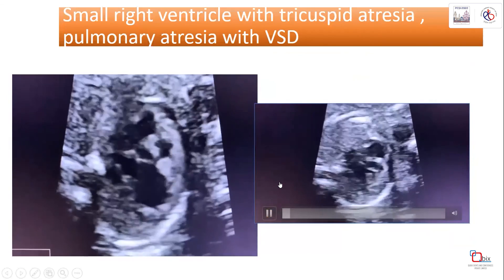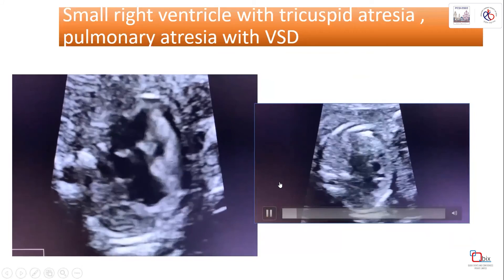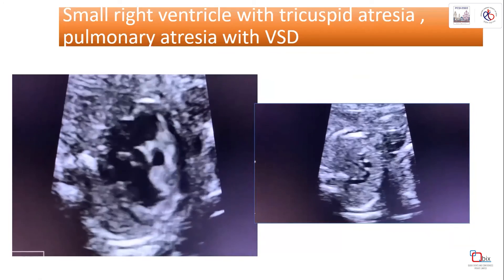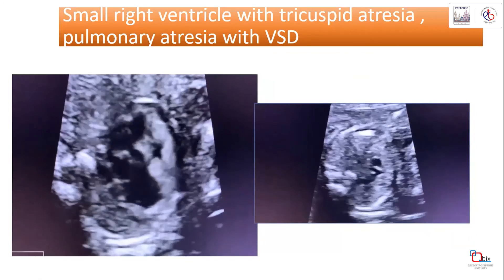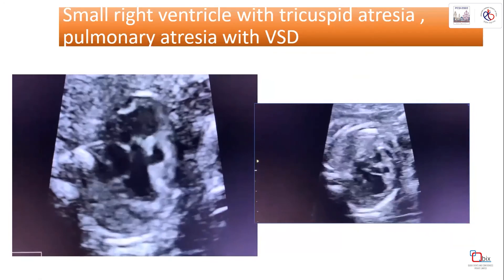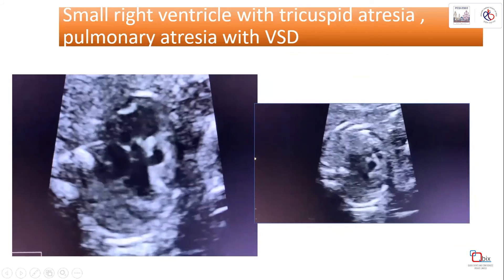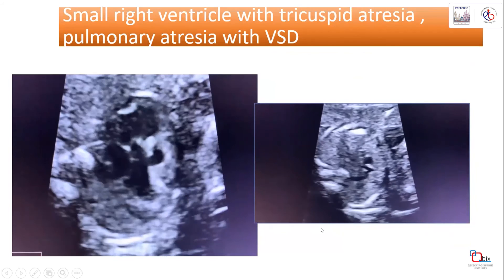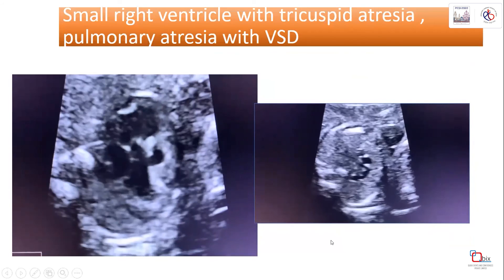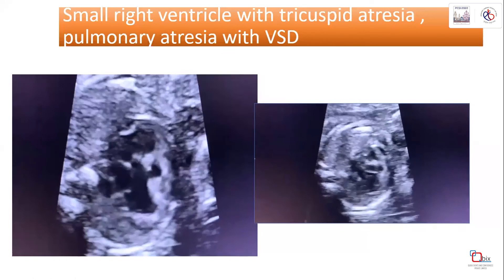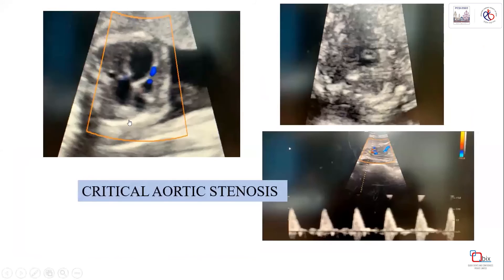This is a case of tricuspid atresia with pulmonary atresia. The pulmonary artery is thin and smaller than the aorta. Color Doppler demonstrates the VSD clearly as well as thinning of the pulmonary artery and retrograde flow within the pulmonary artery.